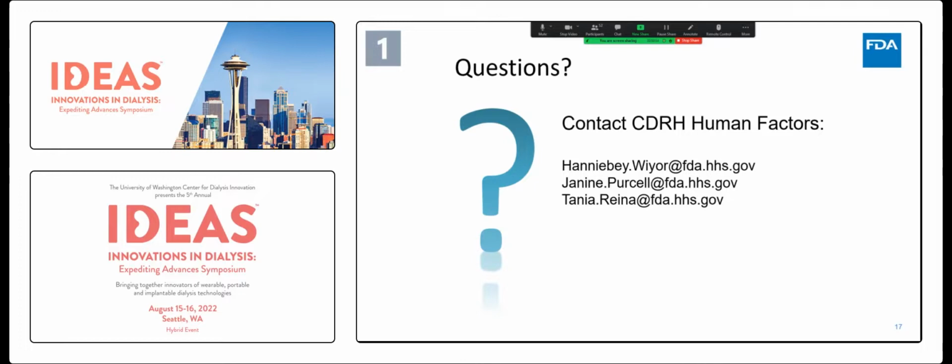And in the United States, again, I reiterate that the way we execute care at home is different than overseas. And really, you need to make all those aspects of training and the user interface design that much stronger so that it can be used successfully at home with caregivers and patients.